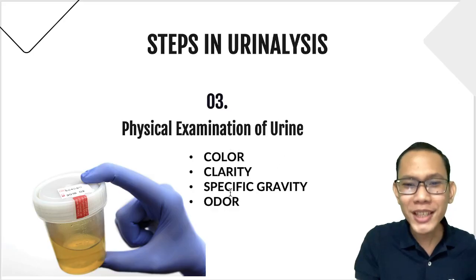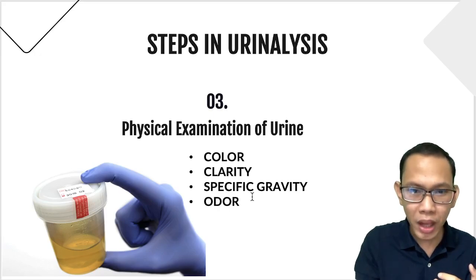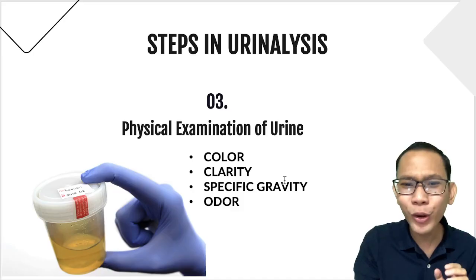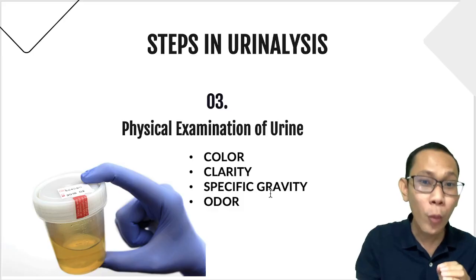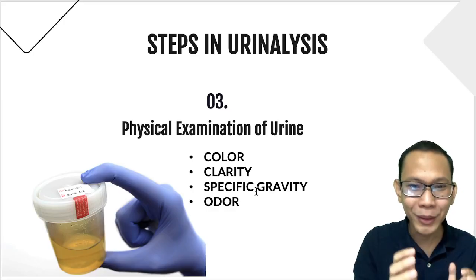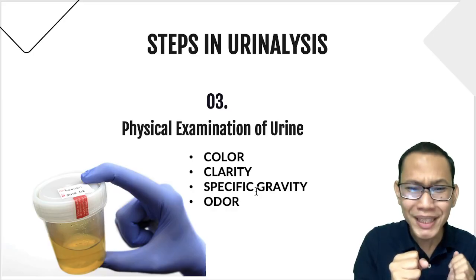Okay? But for the specific gravity, we don't have any problem with that because we have a different methodology for us to measure really the correct specific gravity. But then again, later on, as you can see sa ating reagent strip, which is one way of identifying your specific gravity, the color parameter na naman will be very subjective na naman.